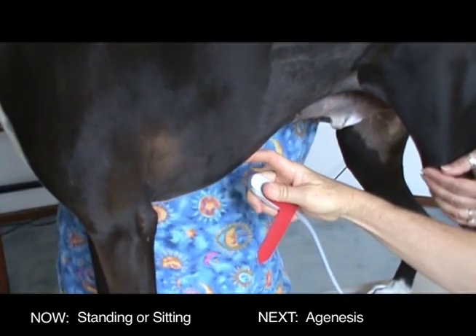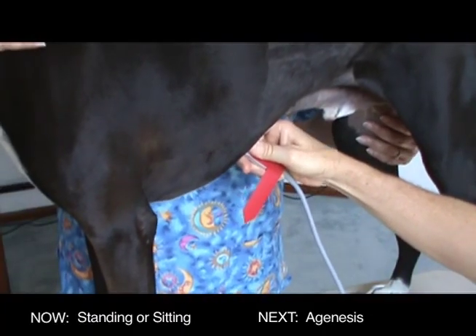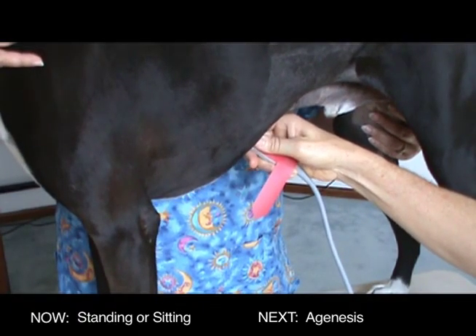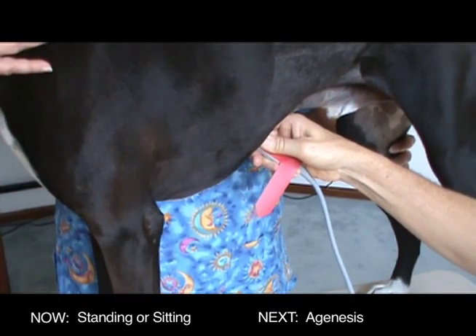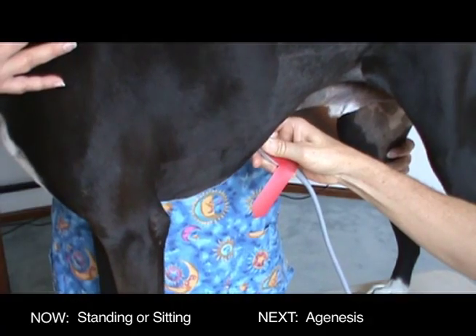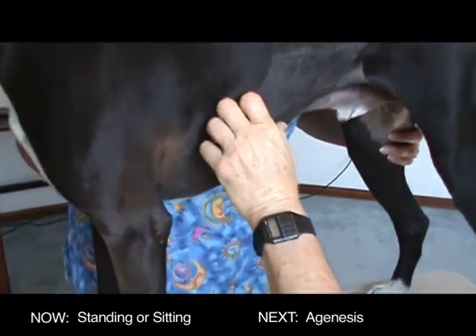In some situations, the patient's gallbladder is viewed first in a dorsal or lateral recumbency position, and then the gallbladder is viewed again with the patient in a standing or sitting position. Gravity-dependent contents such as stones, sludge, inspissation, and mucoid plugs will change positions within the gallbladder. Non-gravity dependent items such as polyps, tumors, and mucoceles will not change positions.